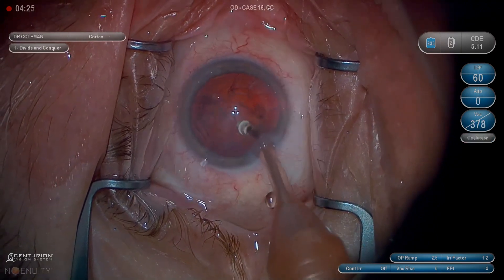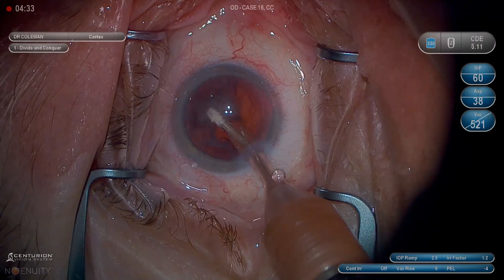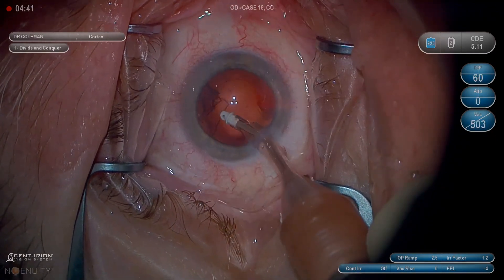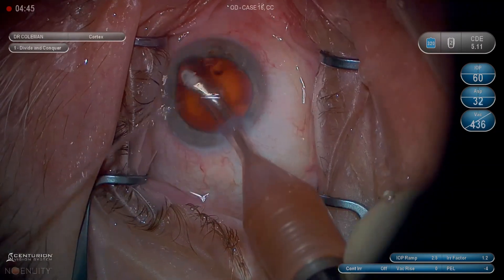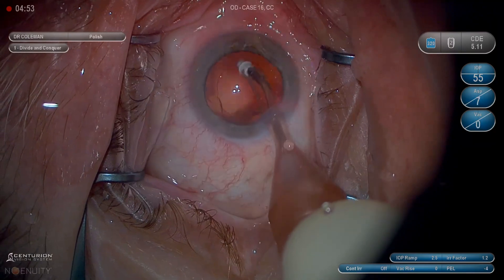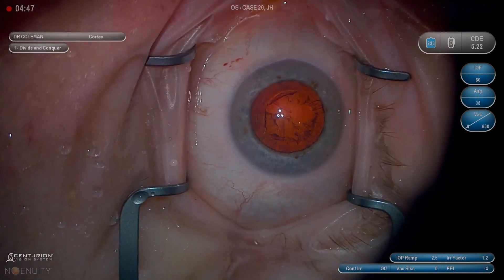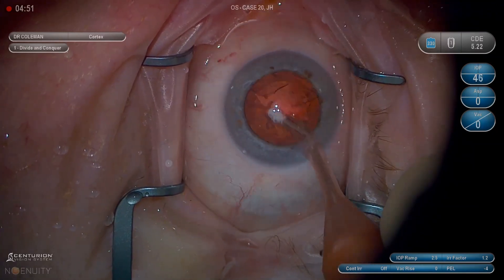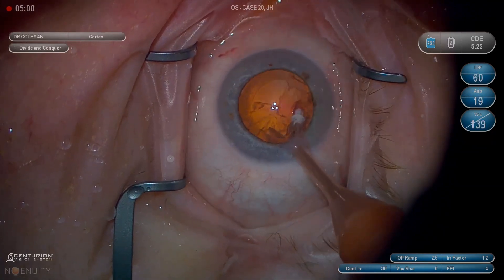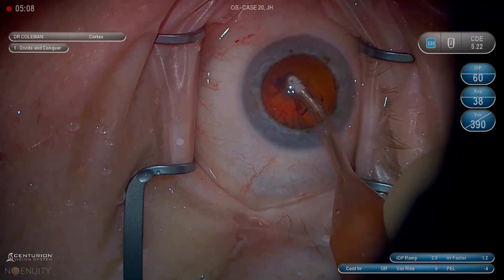We got a big portion there. I'm always ready — I can get a second instrument anytime if I get a little piece of nucleus stopping up the tip. I'm moving in an arc and trying to push it down. Now there's only one quarter left, so I'm going to be pretty careful on that last little segment. We can polish if we want to — I do go to a polish setting. I change settings with the foot myself; I don't have a tech changing settings, so I don't have to wait. Polishing is really about contact — rubbing that tip. For the polymer tip I do more polishing; with a metal tip I do a lot less polishing and a lot more YAG lasers. I always remind my residents and fellows that if you know how to do a YAG laser, probably do a YAG laser. The YAG is always better than rupturing the capsule at the end of a perfect case trying to do excessive polishing — it's an unnecessary step in most cases. It's kind of nice if everything's going well, but don't push it.